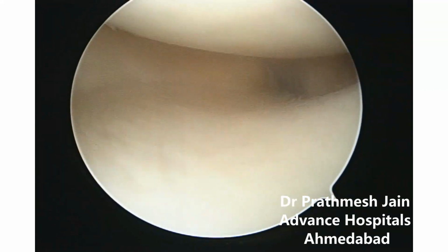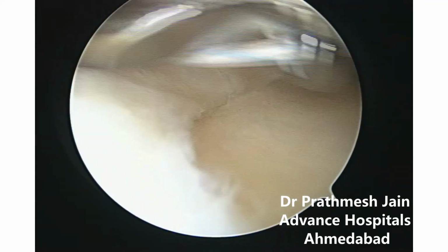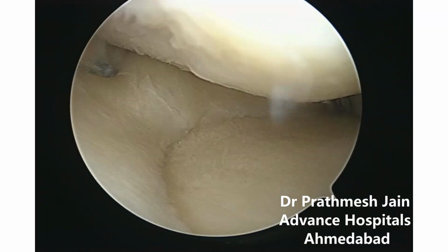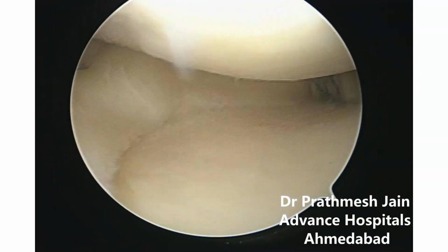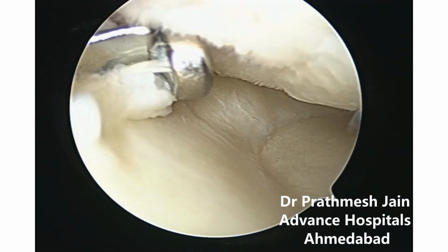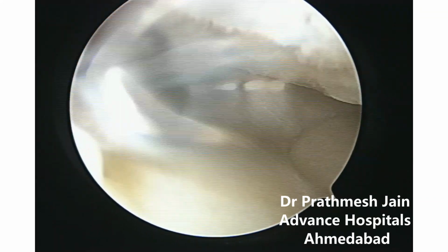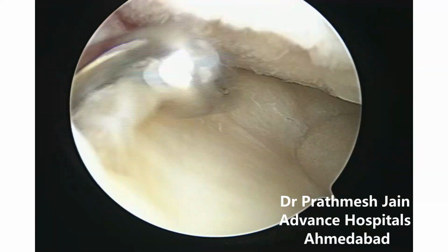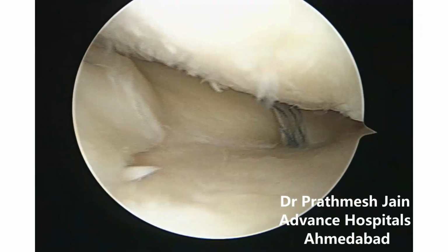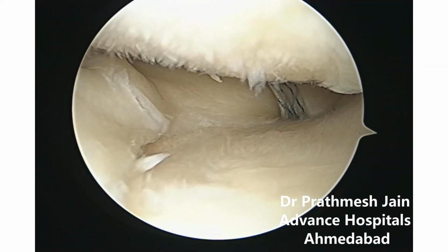Once we do this, we can see that very nicely the meniscus is reduced both from the posterior aspect as well as on the anterior aspect, and this is what we call a repair. We reduce the meniscus extrusion not only from the back by doing a meniscus root repair, but we also reduce the meniscus extrusion from the front by using a repair on the anterior aspect. So this is a very nice repair that we are able to achieve, where we can definitely increase the life of the knee and delay the progression of arthritis to a great extent.